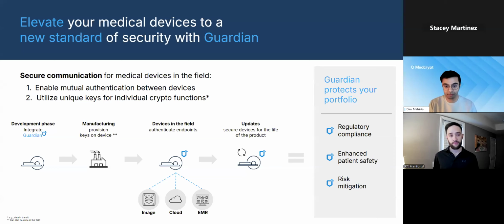In order to do remote updates, you need to make sure security is really thought of. You wouldn't want any person being able to update your device. You want some security controls in place, and in order to do that, you really need to be thinking about security and key management in the design and development phase. Yep, that's a really great point.